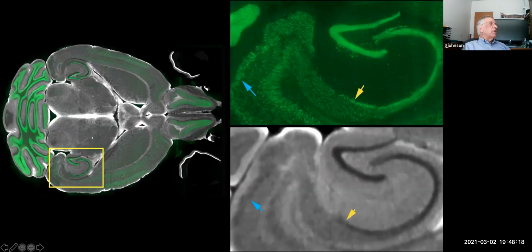And if we now add the NeuN and the other stains, I can show only one at a time. The NeuN has been registered, again, with another pipeline. And if we lay them above each other, you begin to see the exquisite detail that you get from both. This is the dentate gyrus. And look at this subtle little projection of neurons here. You can almost see that you can get it here. And this little projection here, you can resolve it here. Down here, I believe we're towards the subiculum. We see 2 and 3, maybe 4 cells. This is about 4 cells thick, and we're able to resolve them here.